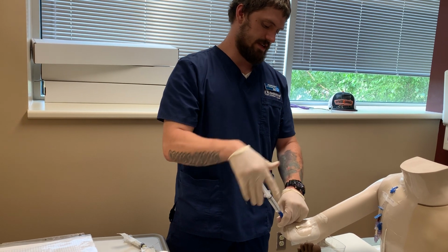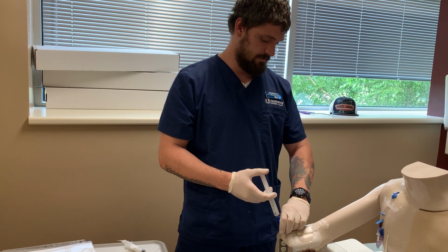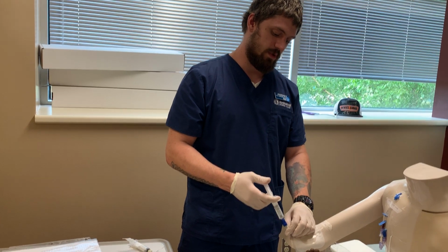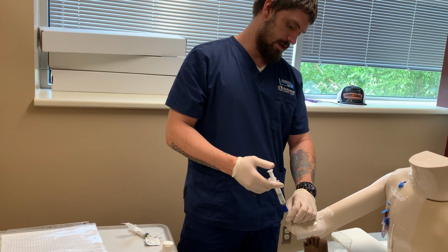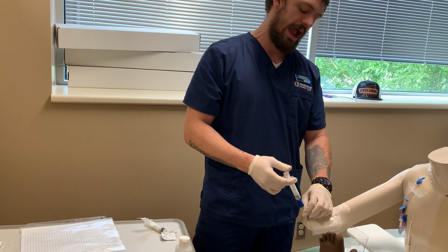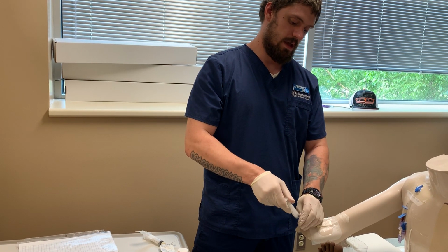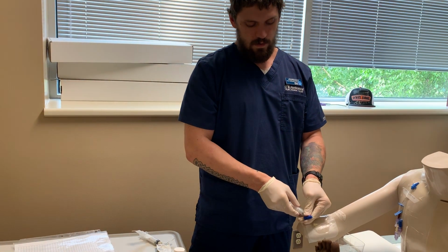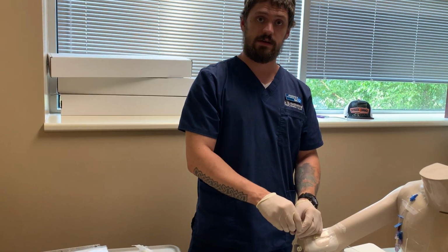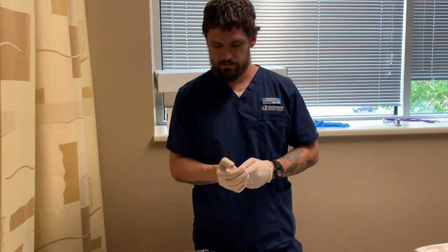For the first 30 seconds of this flush, we will be noting the start time and pushing this over the same duration as the medication. And again, fast forwarding, after that we will use a pulsating flush technique. And as I had said before, for a child we might push this over a longer duration and a smaller dose. Okay. Clamping and removing. We will make sure that we use an alcohol impregnated cap or another sterile covering if need be. And how are we doing, Ms. Doe? Still doing good. Awesome.